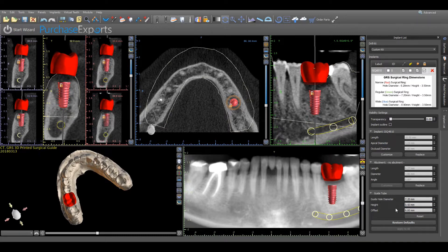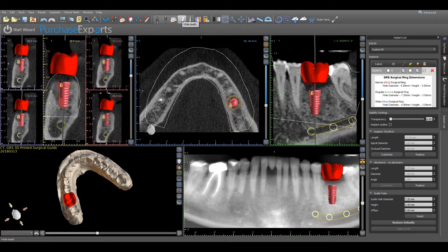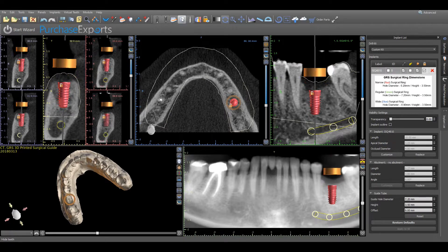Once the adjustments have been made, proceed to the top of the Implant List panel and under Implants confirm that the Drill Guide Visibility checkbox has been checked. Once completed, go to the top of the screen and click on the Virtual Tooth icon to hide any teeth that may have been added during the implant planning process.